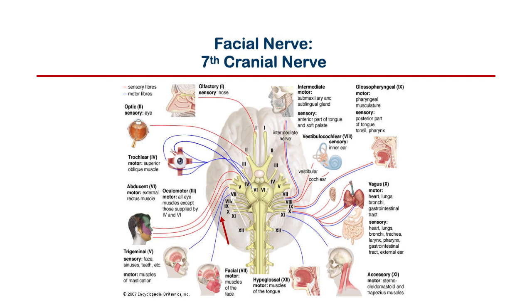And even the facial nerve, which doesn't have any direct connection to communication or to the auditory system, is still within our purview and our scope of practice because we very often have the equipment. For example, we have equipment to record acoustic reflexes, which involve the facial nerve. And of course, we can perform ENoG, and it's right in our scope of practice.